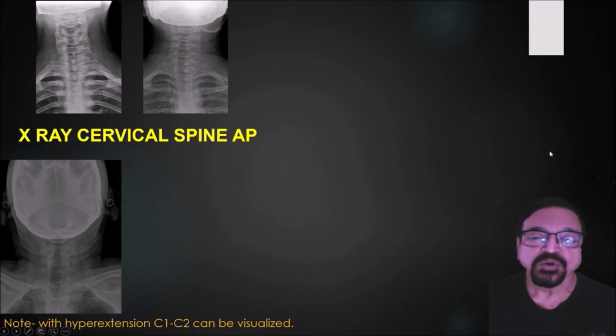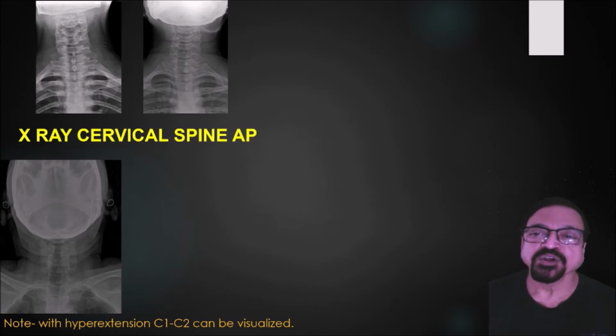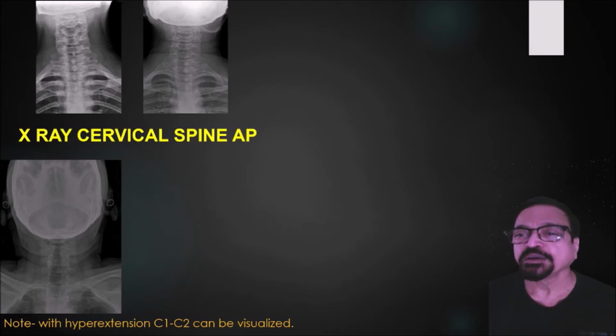it. So a proper visualization of the entire cervical spine can be achieved by two techniques. One is by elevating the chin, and second is by giving angulation. But if we give angulation, there will be distortion of the vertebral bodies. That can be avoided by giving a small angle and elevating the chin a little bit. Both these maneuvers give an extended visualization of the AP projection.